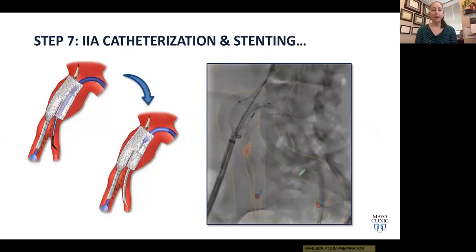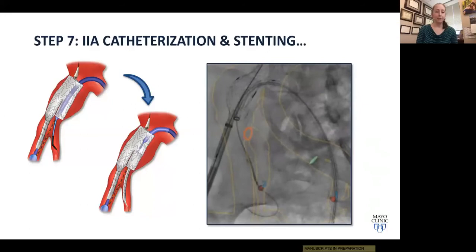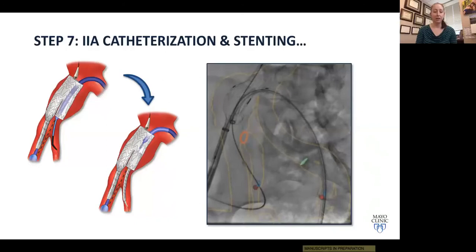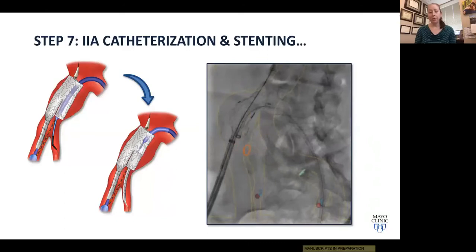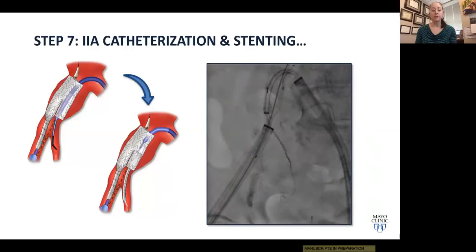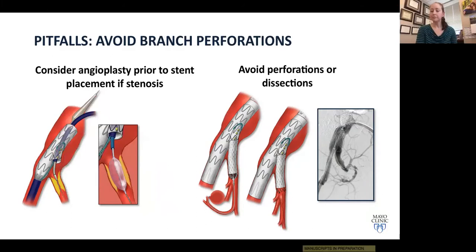At this point, we're ready to catheterize the internal iliac artery and place the side branch stent. I place a Kumpe catheter through the contralateral sheath and use a glide wire to cannulate the internal iliac artery. Once enough wire is in to support advancing the catheter, we advance the Kumpe into the internal, then exchange for the Amplatz wire to support delivery of the side branch stent. Key pitfalls include perforations and dissections — challenging anatomy increases this risk. Shoot a quick angio once the wire is in place to ensure neither has occurred.